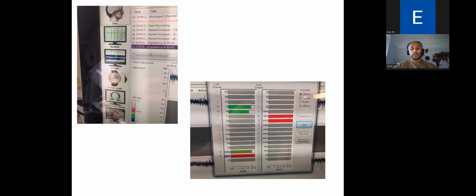So the first thing, as I said, is to check the impedance, as to how well the electrodes are attached. There's a button on our machine which says impedance. You press it and you expect all of these bars to be green. If they're not green, then they're not attached to the scalp appropriately. So you reattach them, ask the nurse to reapply them, and then reassess the CFAM.